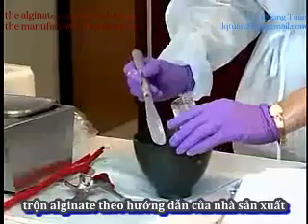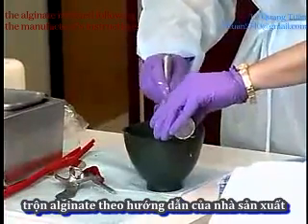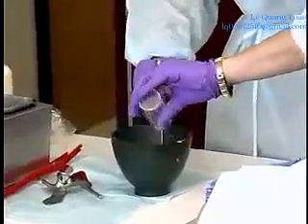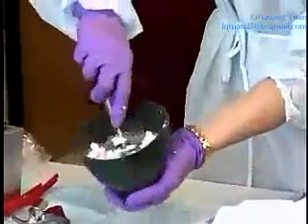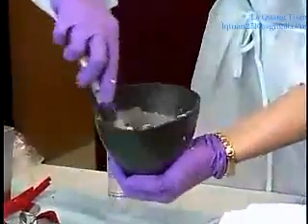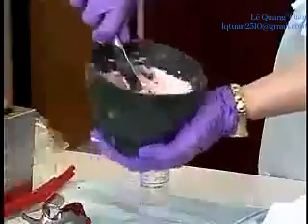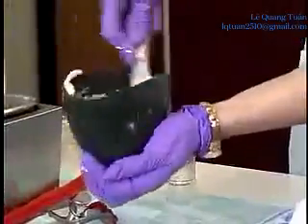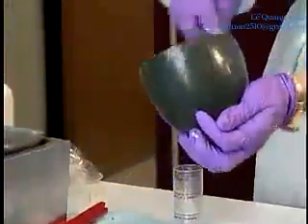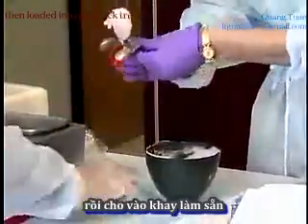The alginate is mixed following the manufacturer's instructions, then loaded into the stock tray.